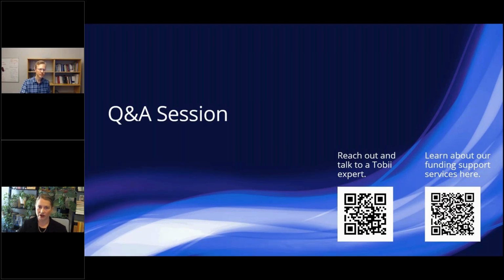Now, for those other eye trackers, you won't be able to use the eye openness blink detection, but you could use pupil diameter or pupil availability blink detection. Marcus, do you have those still available? Pupil algorithms for blinks? Yeah, it's included in the same GitHub repository. If you're interested in rate or durations, the pupil size signal is good enough, as my plots showed. So you don't necessarily need an eye openness signal if you're just interested in rate and duration, and you let participants sit in the center of the head box so that you record data with high quality.